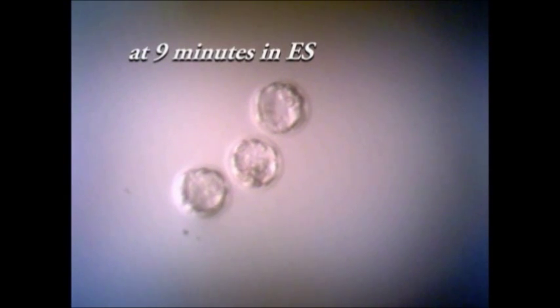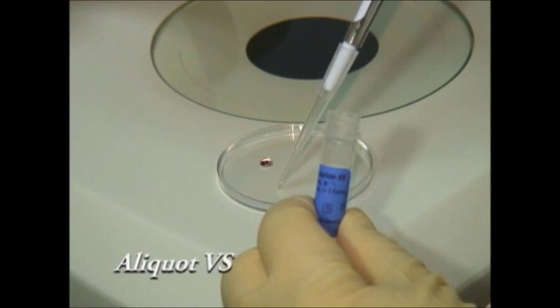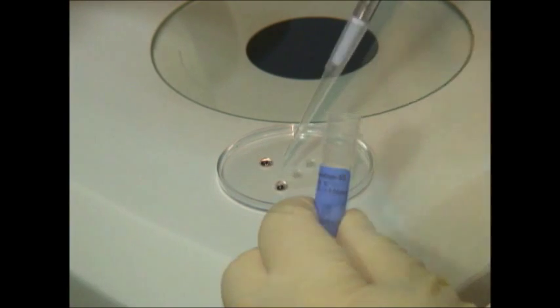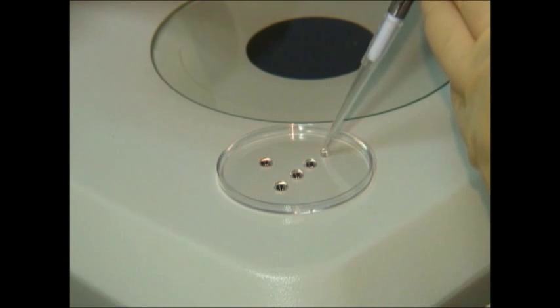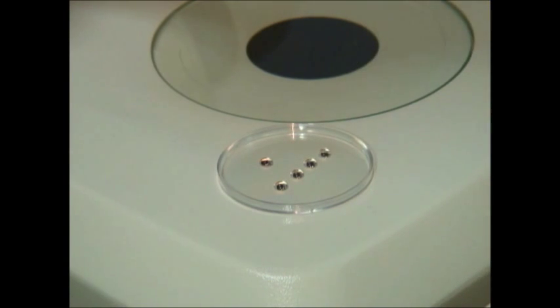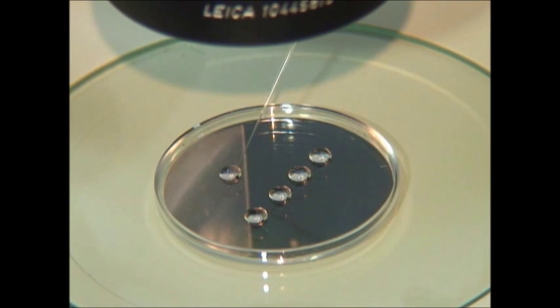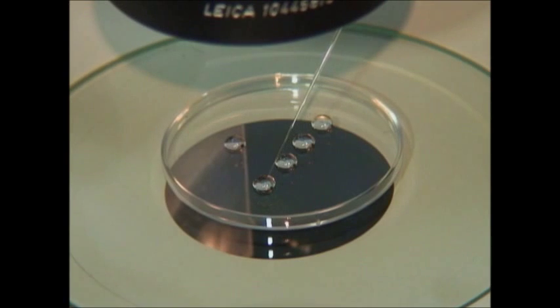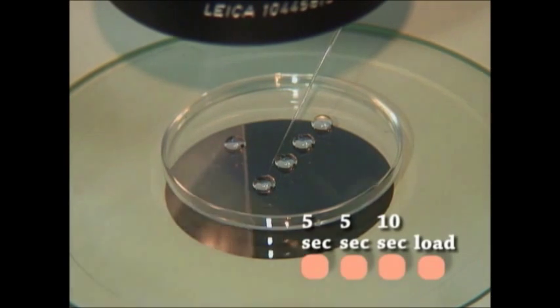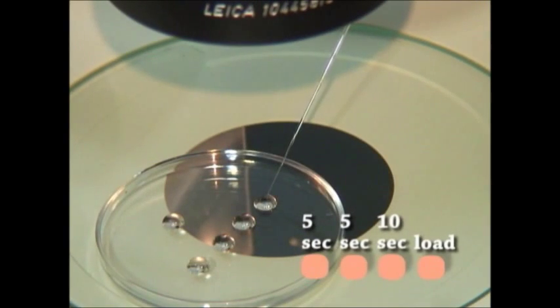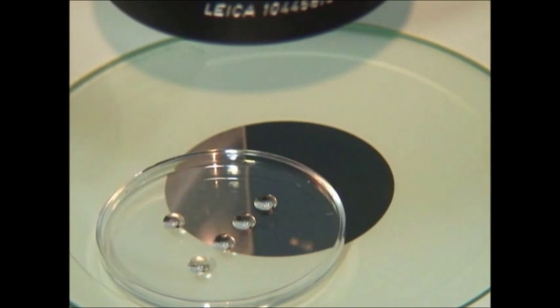During this time, similar to as detailed above for oocytes vitrification, four drops of vitrification solution is made in the bottom of the dish and the embryos are washed in them for five seconds and then again for five seconds in the second drop and 10 seconds in the third drop and then placed in the fourth drop.